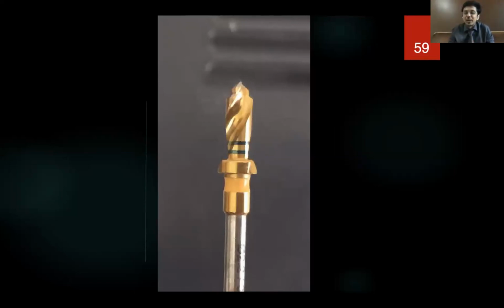Good, nobody. How many of you are saying more expensive? Excellent. Okay, so basically, your kit price is determined by the number of drills. Now, suppose for a particular length of implants, 10 millimeter implants, we have one set of drills. 11.5, we have another set of drills. Naturally, the overall cost of the kit is increasing.